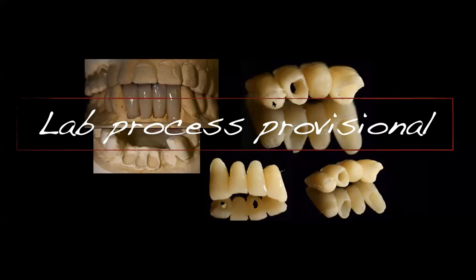Okay? This is the case. Going back to the provisional, as a restorative doctor, you need to tell your lab to overbuild the lingual portion of this provisional.